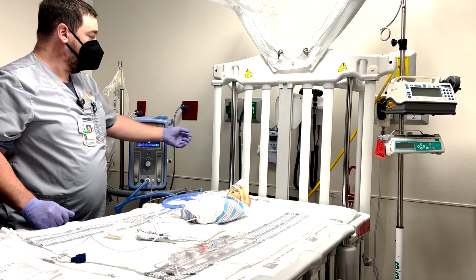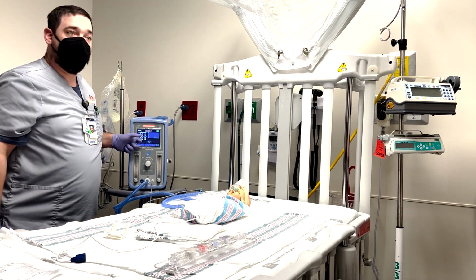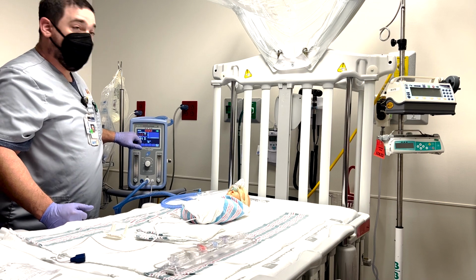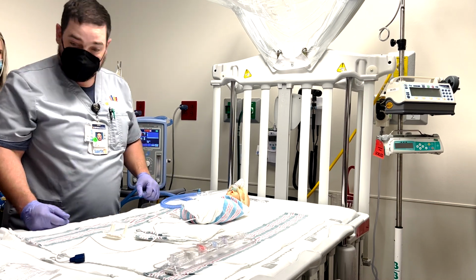If it's an oxygen failure, your oxygen comes out and you have a baby who's on 40%, your oxygen is going to go down to 21%. If it is an air failure, it's going to go to 100%. That is an analyzed value on your baby. Okay? So far, so good.